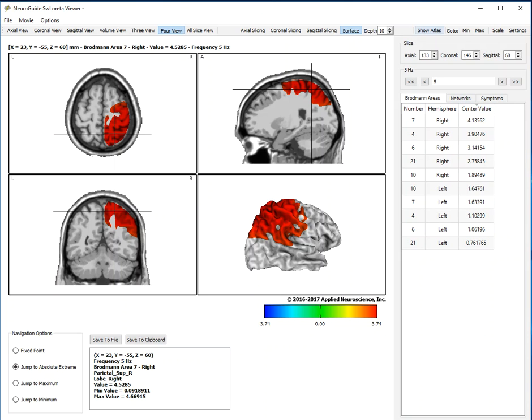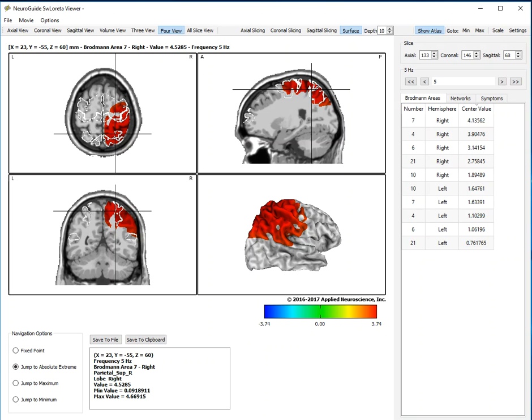You can turn on the Atlas to identify the Brodman areas that make up the anxiety network. This is the demo patient who is damaged in the right hemisphere. So the anxiety network is here.